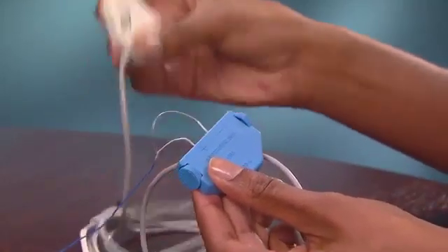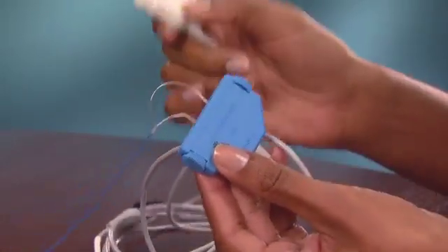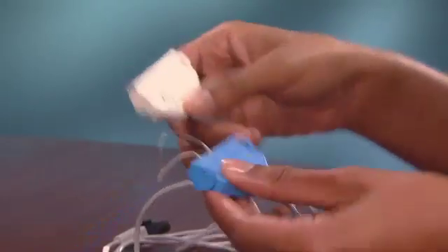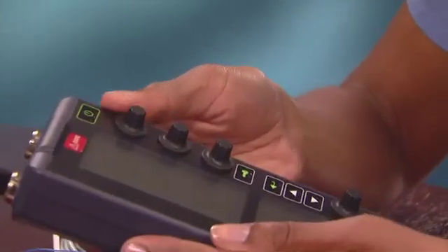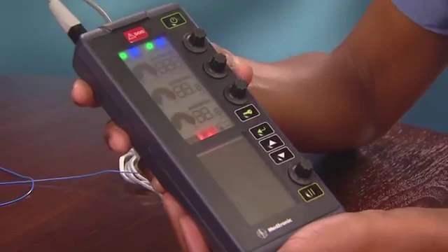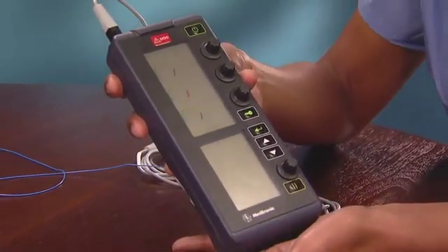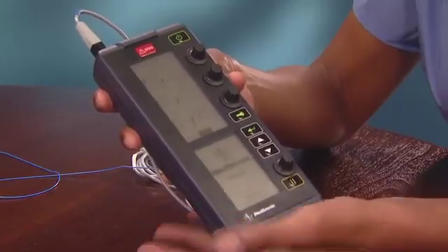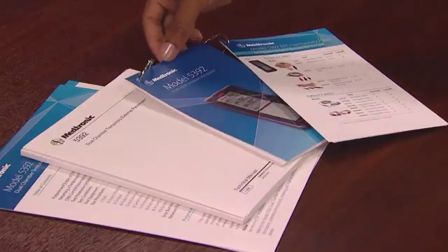Notice that the leads are also color coded: blue for atrium and white for ventricle. Now you're ready to turn on the 5392. You will need to determine sensing and pacing thresholds. Medtronic recommends that you use a safety margin of 2 to 1. Check the quick reference tip card for the appropriate steps.